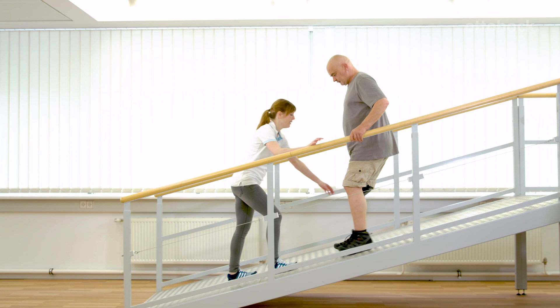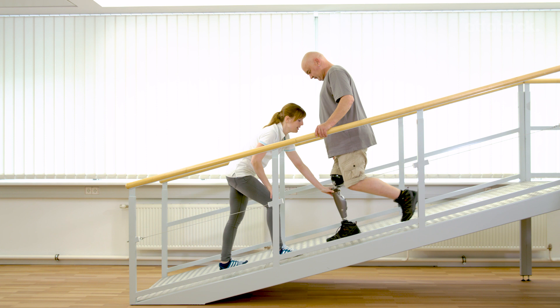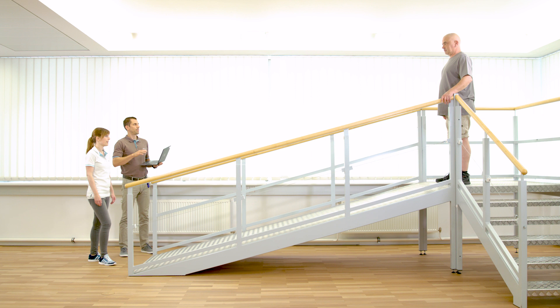Franziska shows Gerhard how to stop on steep slopes and how to use the intuitive stance function for secure standing. If Gerhard stands still with a slightly bent knee, the knee locks in the flexion direction and can be fully loaded. The stance function is deactivated when rotating forward or unloading the prosthesis. Gerhard shows the transition from the intuitive stance function to yielding.